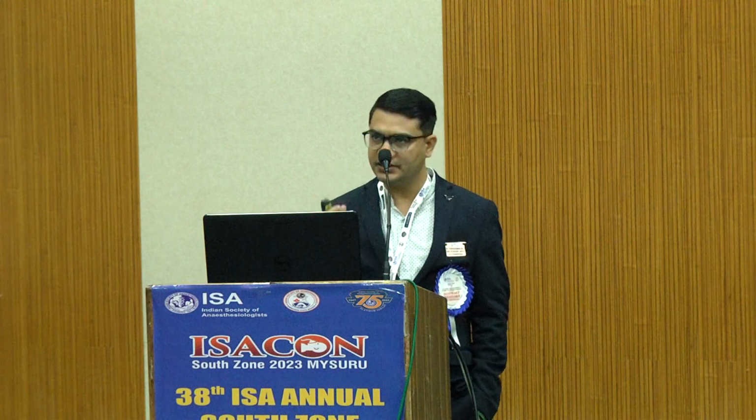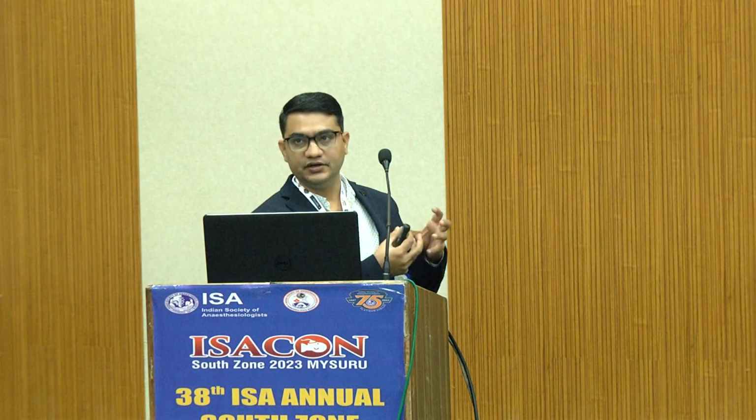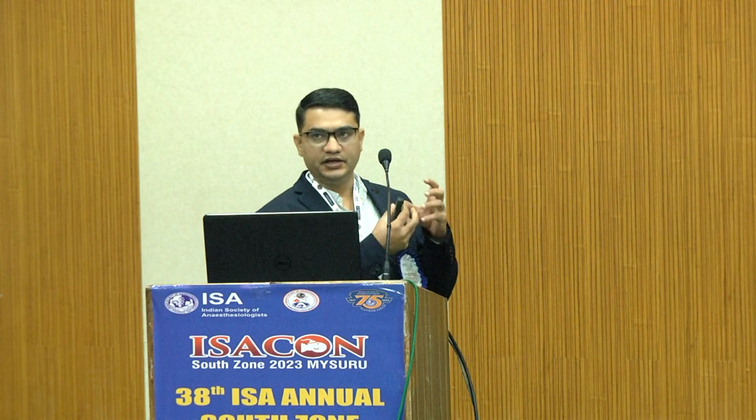In diastole, the amount of hemoglobin decreases and it increases during systole. So there is a ratio: the absorption of red light during systole and diastole divided by the absorption of infrared light during systole and diastole. This ratio is called the modulation ratio or R ratio.